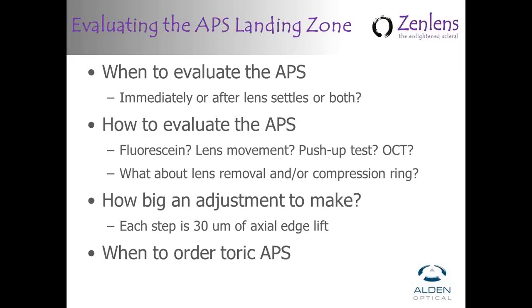When a patient comes back for a week or two follow-up with a lens on their eye for a few hours, let's say, I always like to put fluorescein on the superior bulbar conjunctiva and watch it interact with the edge. A properly fitted scleral shouldn't have a lot of tear exchange.